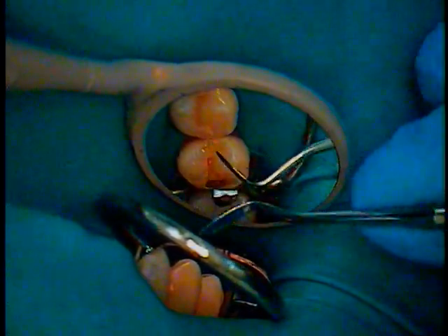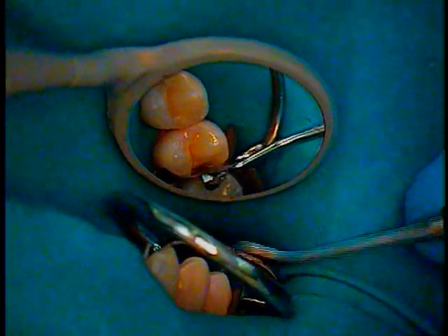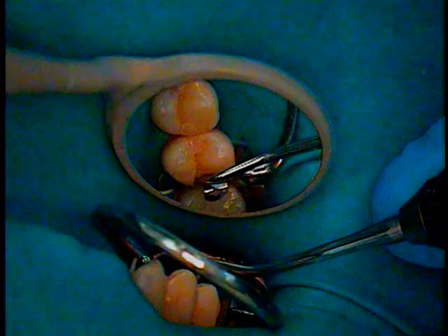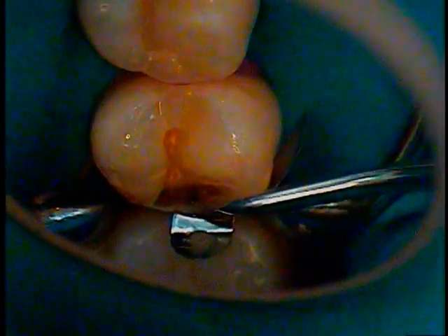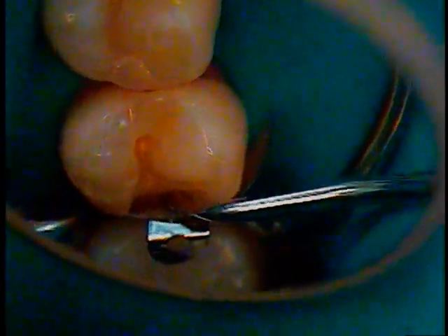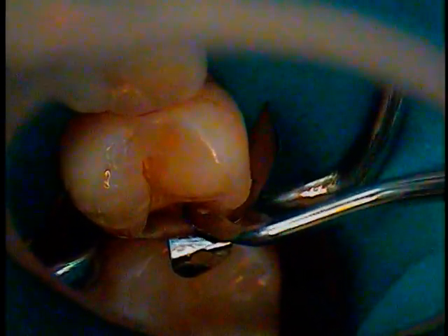Push and pull, push and pull. We're not going vertically here. We're staying horizontally. Use a Hollenbeck. Gets in there nicely. Take a close look. Okay, use a microscope. Don't do any guesswork out there. Get a microscope, or get good loops and get something with magnification.